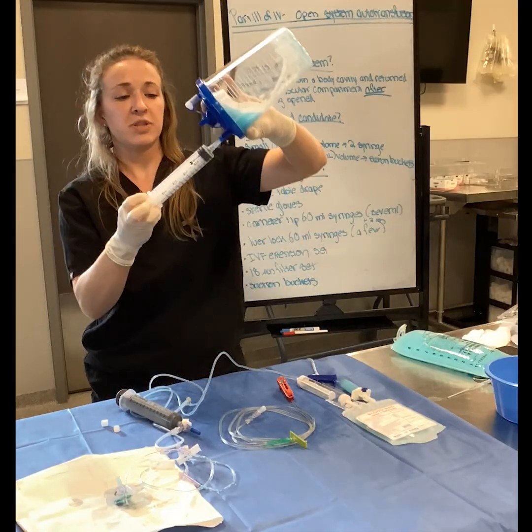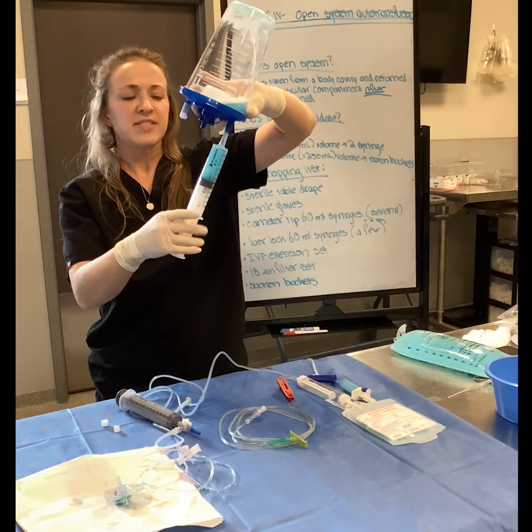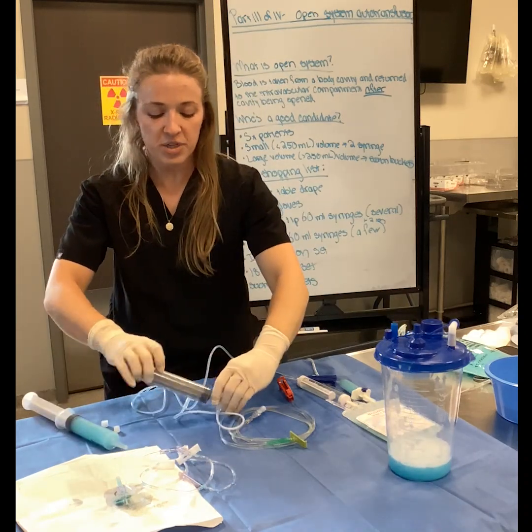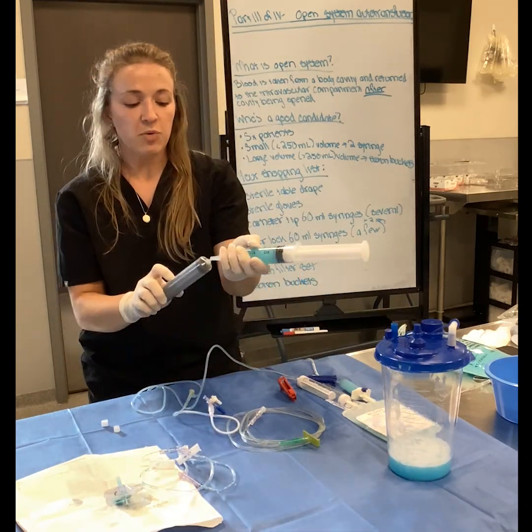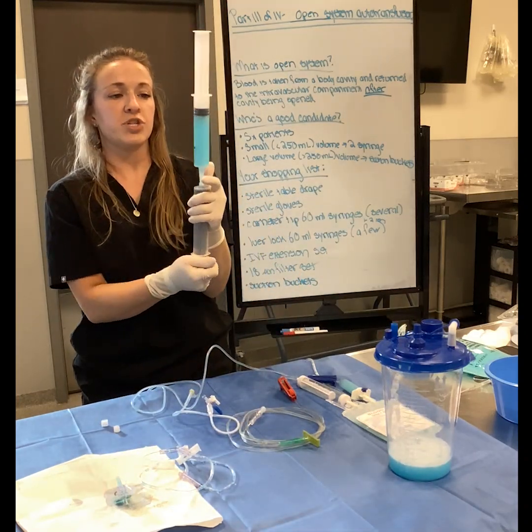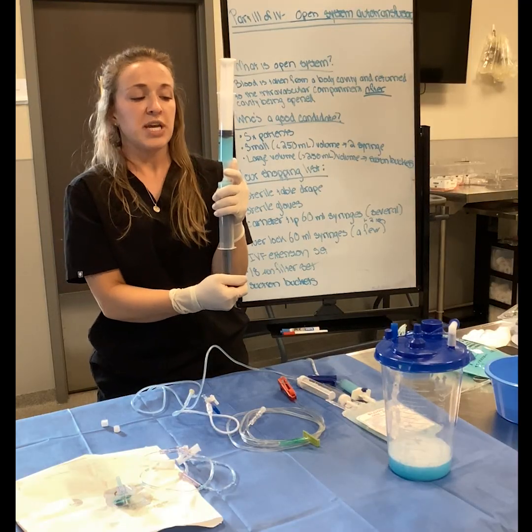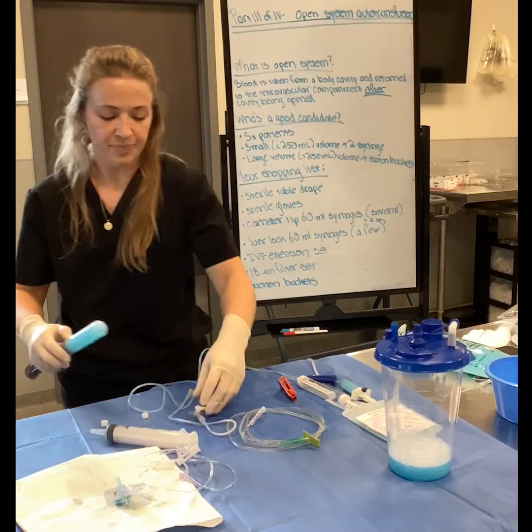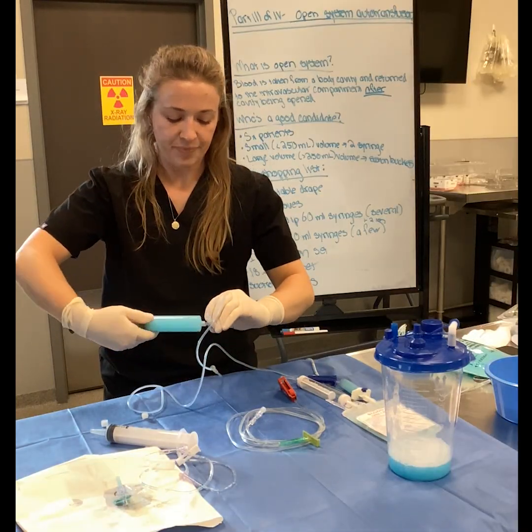And I could just keep doing this all the live long day. And the thing is, this is much faster with multiple people, but it is absolutely possible to do this as a sole surgeon. So if you are either working totally by yourself or your technician has a lot of stuff to do, just get the blood into buckets, close up the buckets, and do it post-op. That's not a big deal. You do what you can.